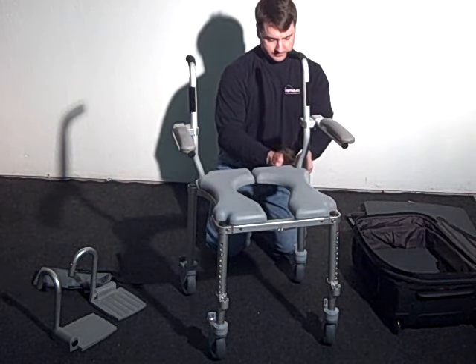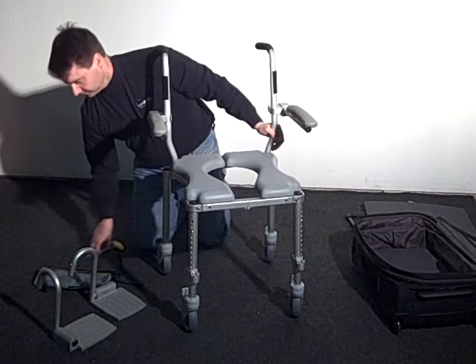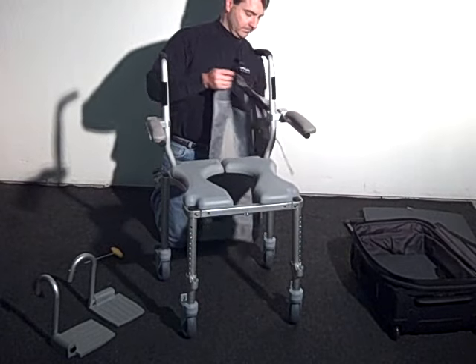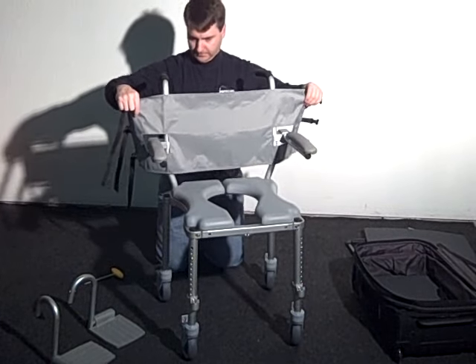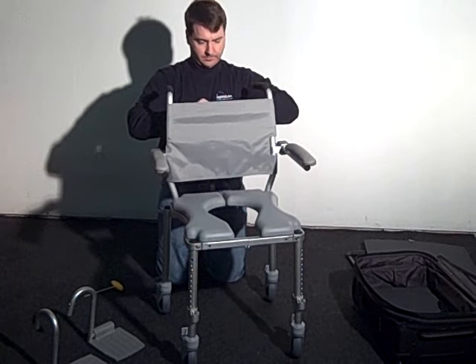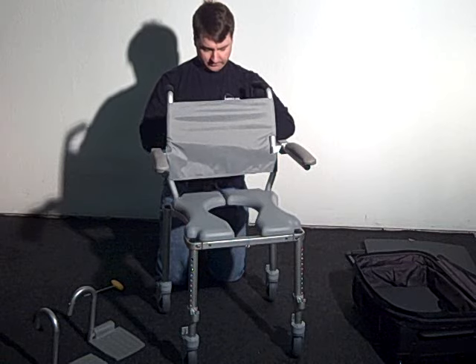Once in place, tighten the internal post clamps using the T-handle Allen wrench. The next step is to slip on the cloth back by sliding the cantilever arms through the windows of the cloth back. Then wrap the sides around the back post and secure it in place with the Velcro on the back post. Then snap the Velcro straps together. Adjustments can be made to the strap lengths allowing for some adjustment in cloth tension and back angle.